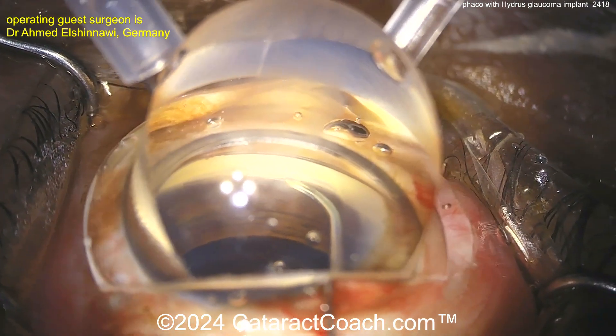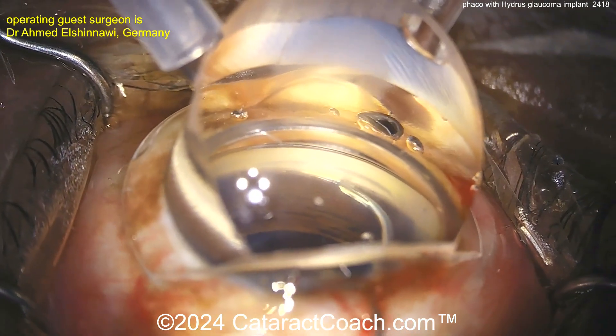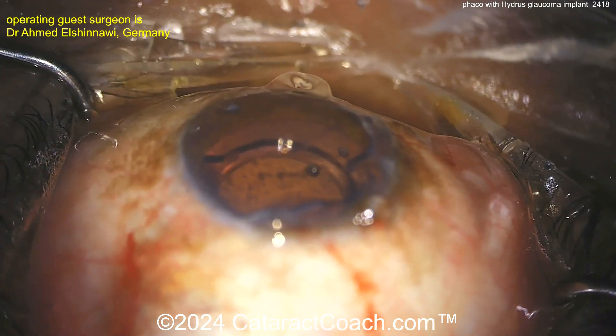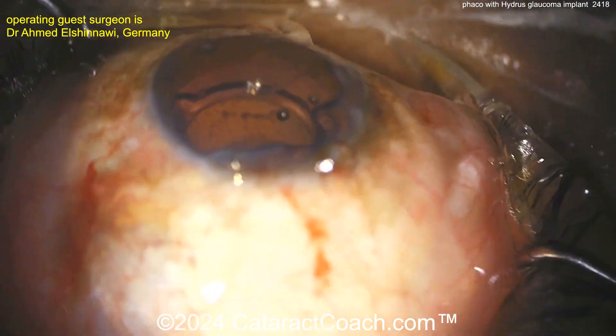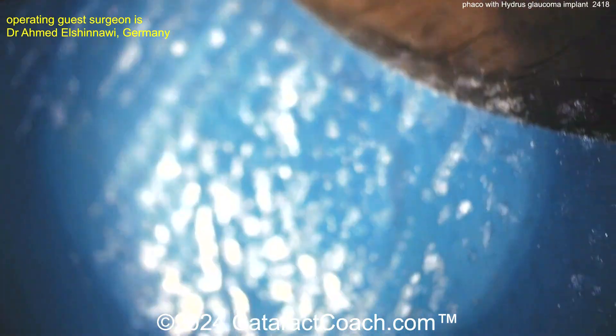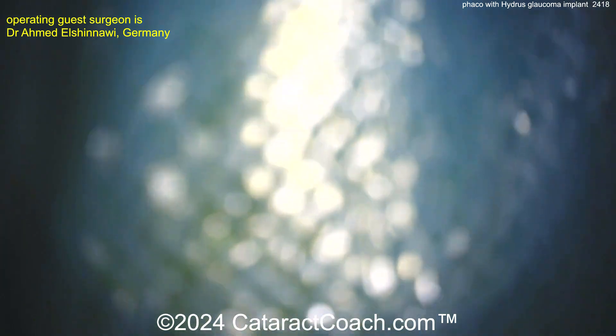Very nice — push it in and make sure you're content with its position and placement. At this point, go ahead and put the scope back in position, tilt the patient's head back to where you need it, and then put in the I/A probe and remove the viscoelastic.